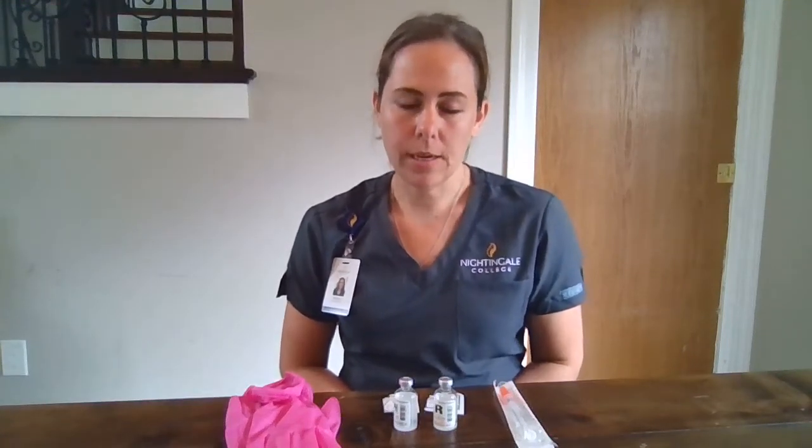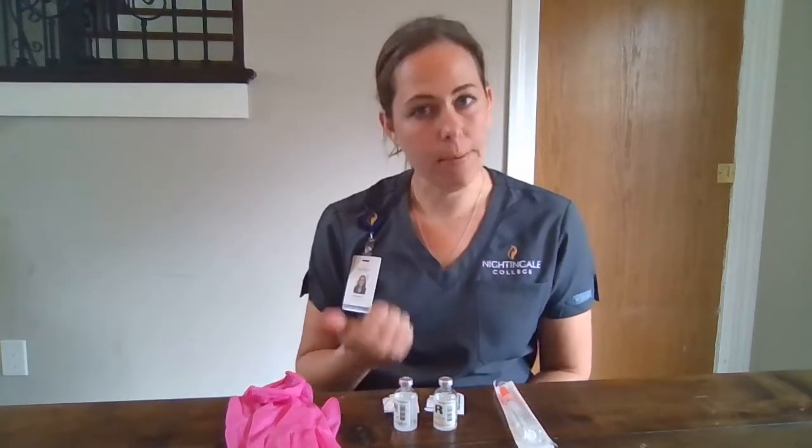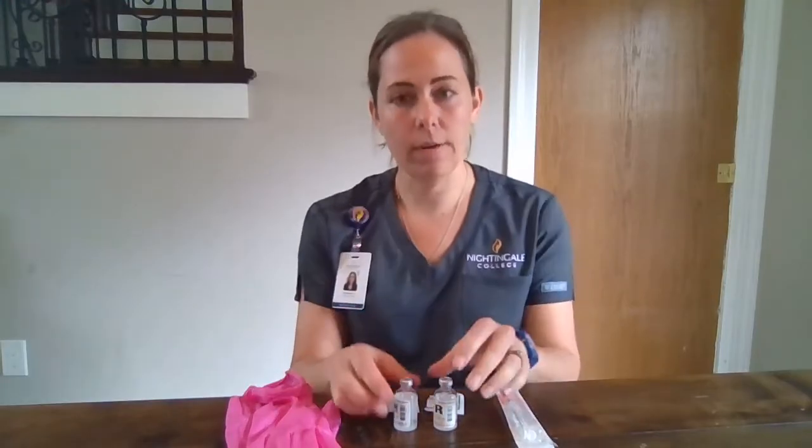Hi, I'm Kimberly Treon, and I'm going to demonstrate drawing up insulin. I'm going to start by verifying my physician's orders and verify the six rights of medication administration: that I have the right patient, drug, dose, route, time, and documentation. I'm going to pull up my patient's EHR, verify the order in there, and verify my pulled vials against my order.